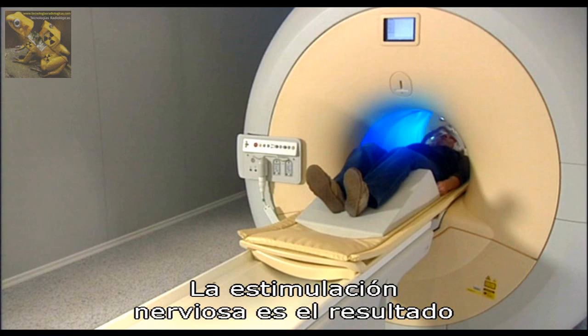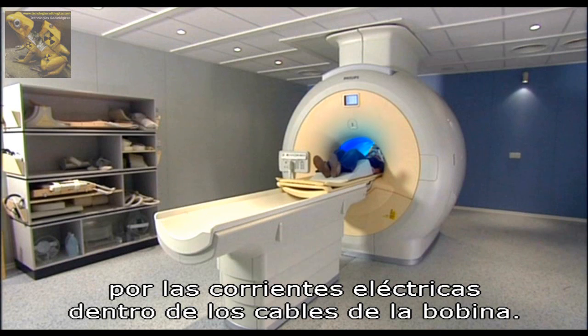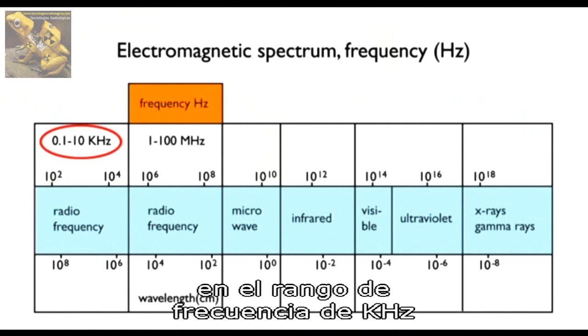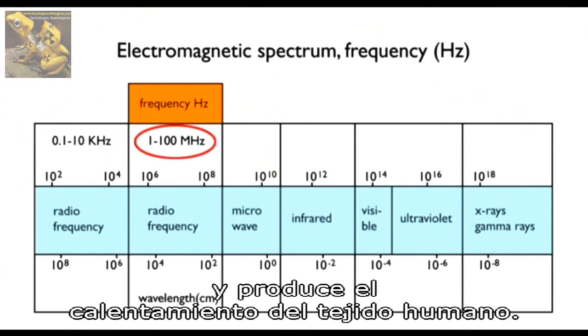The nerve stimulation results from the electromagnetic fields generated in the human body by the switched electric currents in the copper leads of the gradient coil. This effect is observed in the kilohertz frequency range as opposed to the RF system, which produces electromagnetic fields in the megahertz range and results in heating of the human tissue.